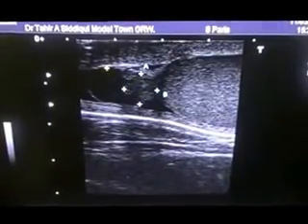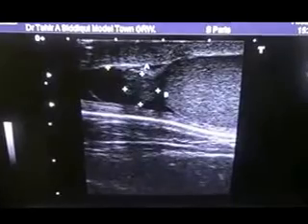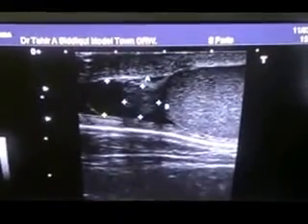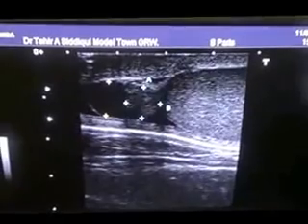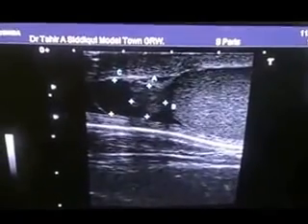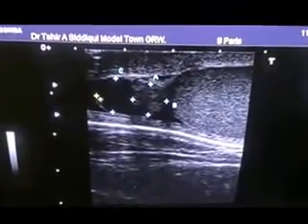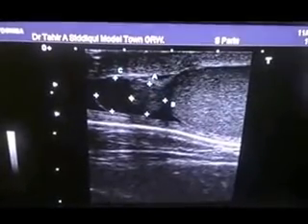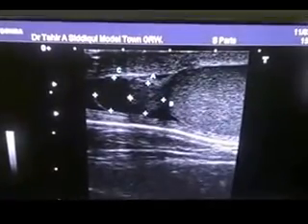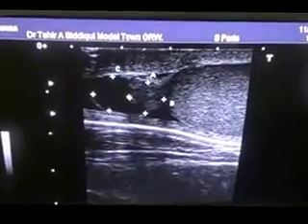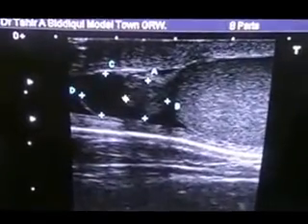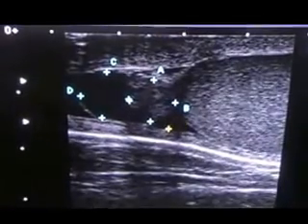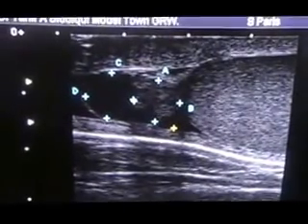You can see there is a cystic area that communicates with the epididymis. This cystic area is prior to the epididymis, measuring approximately 6.8 mm. It is clearly anechoic with no debris seen. A small amount of fluid is also seen, which is normally seen — not a big deal.